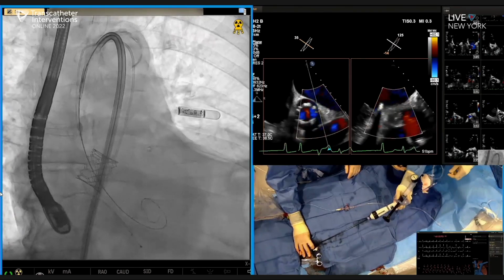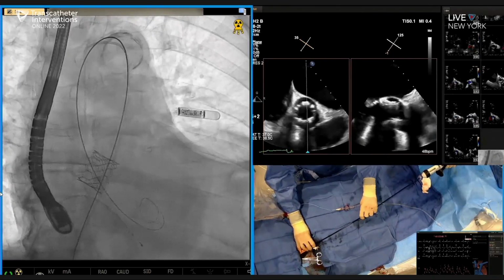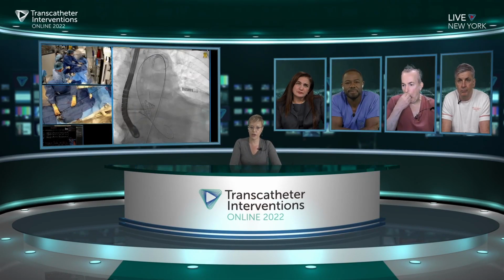Let's get a catheter and get hemodynamics and do a quick angio, because I know we're running out of time here. No, Sushil, we'd like to see the final root shot as well. But exactly. While you're exchanging, David, what do you do with this? What if this patient is a 65-year-old and not a 95-year-old or 85-year-old? I mean, it's usually no harm if you want to post-dilate with exactly the same volume just to get rid of any recoil. But what we saw on the echo there was a wire-related leak.